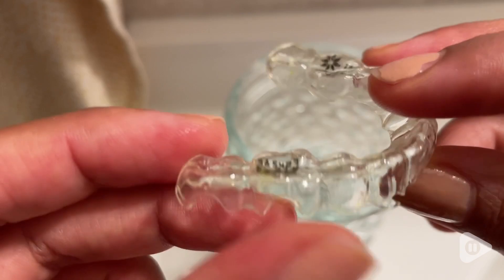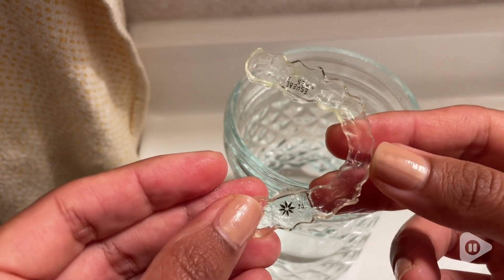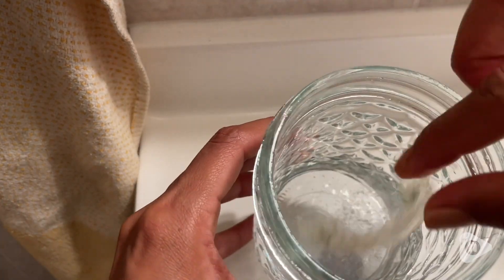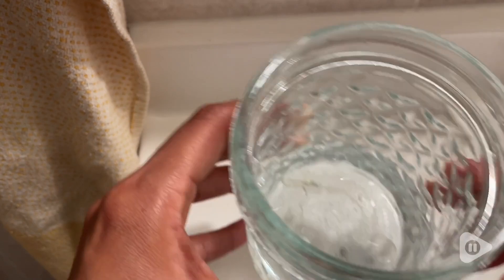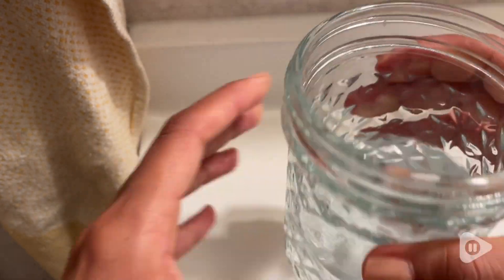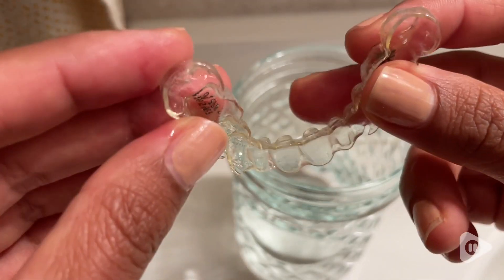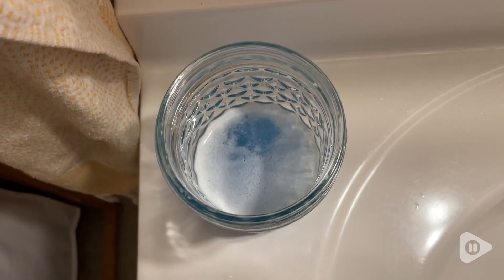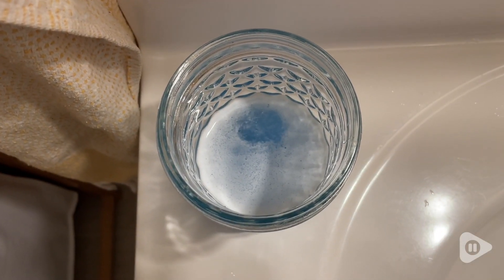You just need one tablet that quickly dissolves into water. These are my Invisalign — they don't have a lot of stains, but I don't like the odor they get. By putting the tablet in the water and soaking my Invisalign for 15 minutes, I was able to quickly see results.